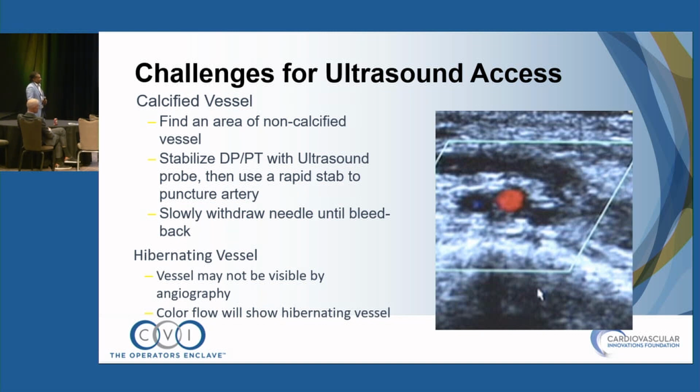And the nice thing about long axis, if you can get the veins away from it, is you can see everything. You can see the needle penetrate, you can pass the wire and pass it up. So, yeah. And it depends. Absolutely. You can approach it anterolateral, like fluoroscopically, or you can go from posterior for a peroneal. And like you were mentioning, don't be afraid to use higher tibial access. So for example, if I'm going to fix an SFA, I'm not going to stick the DP, I'm going to do a high AT stick to fix the SFA, just because you're going to be a little bit closer.